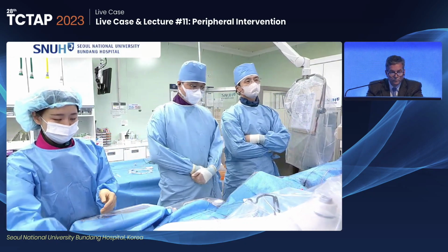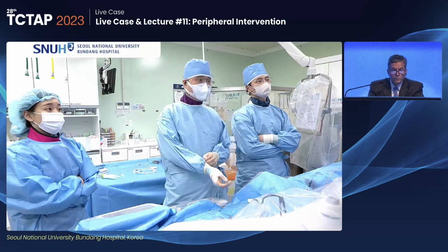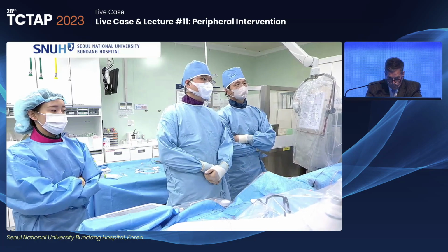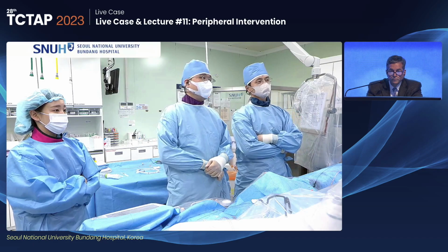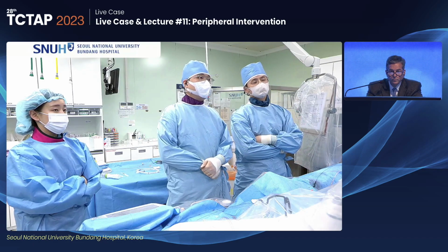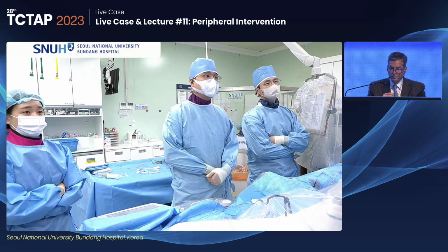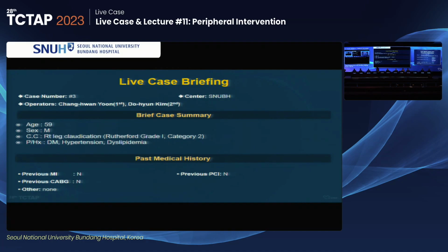Okay, today we are preparing a common iliac artery occlusion case. It looks simple, but I already started this patient, and it doesn't look simple. But anyway, let me start this case. Dr. Kim, could you introduce our case? Okay, I will present you the live case number 3.